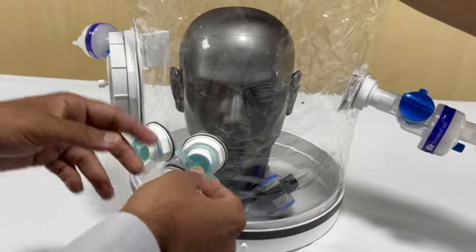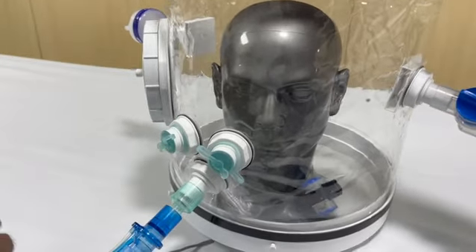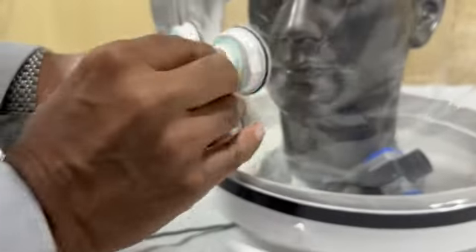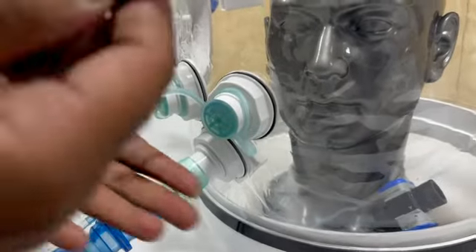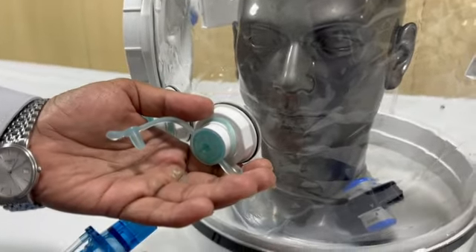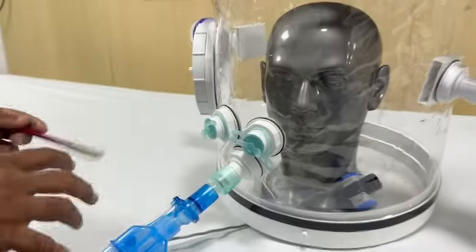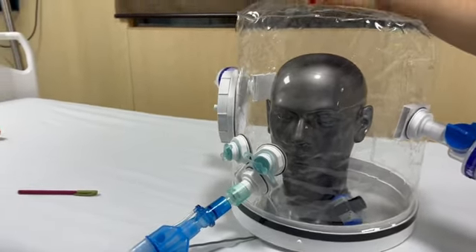Whereas this port is actually also used for feeding the patient. For example, if I want to feed the patient, it's best to give the patient liquids. How do you do that? You open this up from here, and then let's assume this is a straw. Let the straw go in from here, go to the patient, and then put the glass down here, and he can sip it from there. With this, the PEEP will not move. This is how you would feed your patients or make your patients drink.